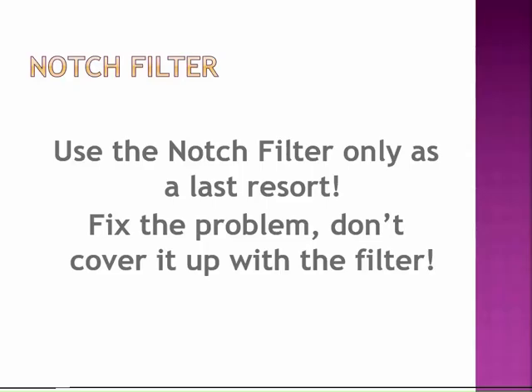You don't want to be in the habit of applying all these filters, making your signals look pretty, and then have poor integrity of your channels to begin with. The purpose is to have a quality hookup. And you can use the notch filter as a last resort. Maybe you have a patient that has very sensitive skin. You weren't able to scrub as much as you normally would, or something like that. They really should be your absolute last resort.